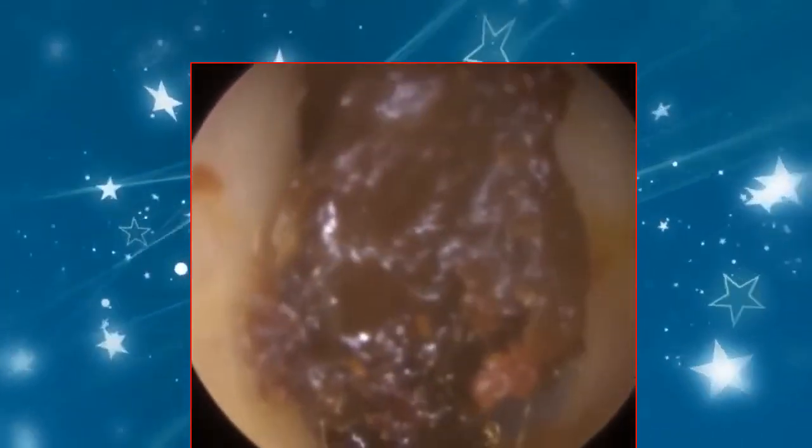And let's see if we can also show you the second bend. And the second bend is just here to the right, where we just went past. So that's the second bend. And after the second bend, the ear canal more or less straightens. And that S-bend, that curvature, is an evolutionary trait designed to protect the eardrum from any objects going directly into the ear and then therefore perforating the eardrum.